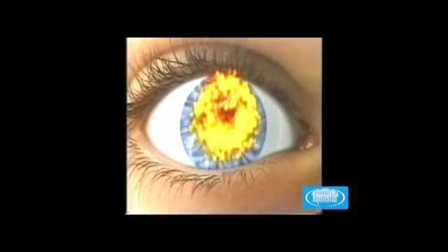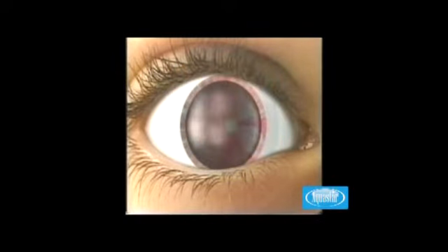Inadequate constriction of the pupil occurs particularly in congenital aniridia, traumatic mydriasis, or coloboma of the iris. Inadequate constriction greatly worsens image quality. Another deficiency of a pathological pupil becomes evident with oncoming light. The eye is extremely sensitive to glare because of the deficient regulatory mechanism. These phenomena are greatly potentiated by the presence of a cataract or also pseudophakia.